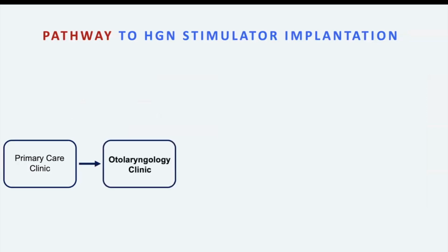Pathway to hypoglossal nerve stimulator implantation. A patient presents to primary care clinic. The patient is then evaluated, and positive airway pressure intolerance is identified. Consideration for referral to an otolaryngology clinic is identified for further evaluation.